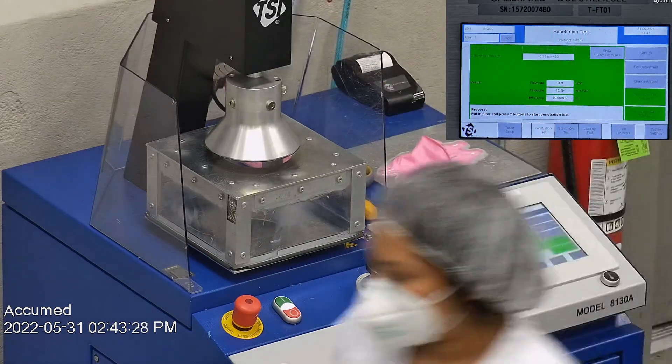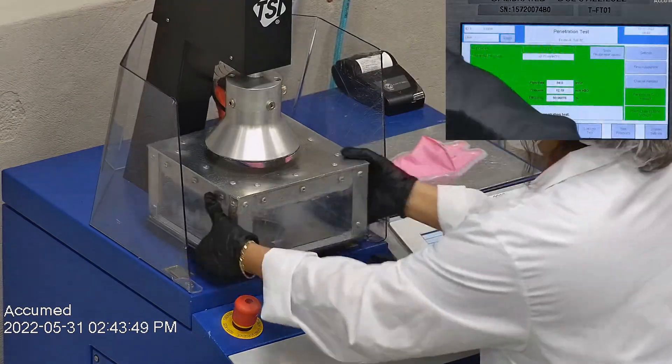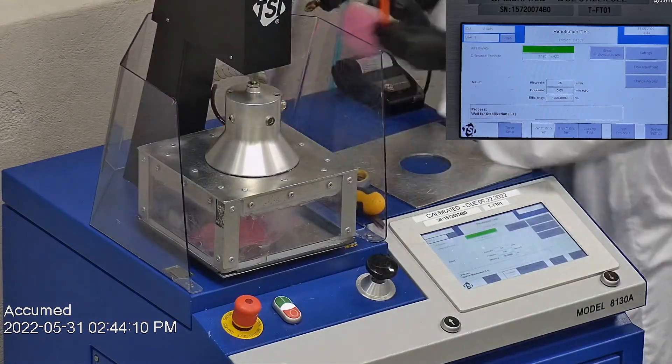The results are displayed on a TSI monitor. F stands for airflow rate, which we test at 85 liters per minute. R is for resistance, also referred to as pressure drop — this correlates with breathability, so the lower the number, the more comfortable and breathable the mask is. E stands for filtration efficiency percentage.